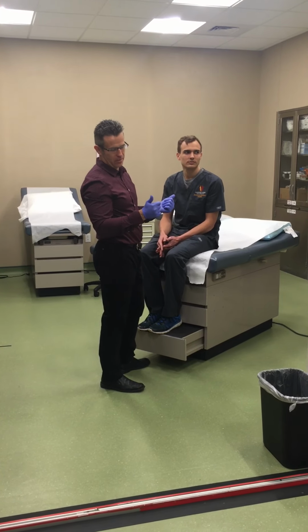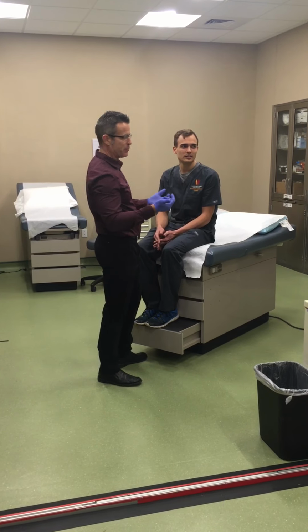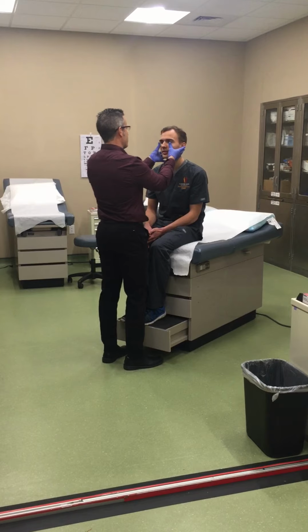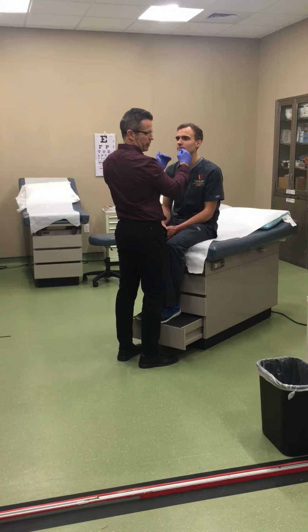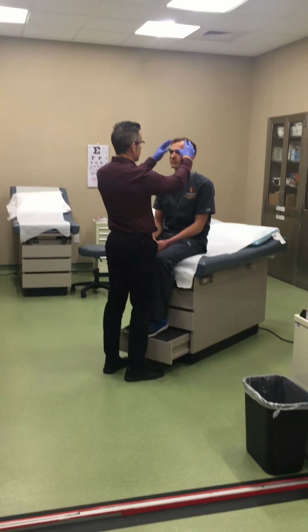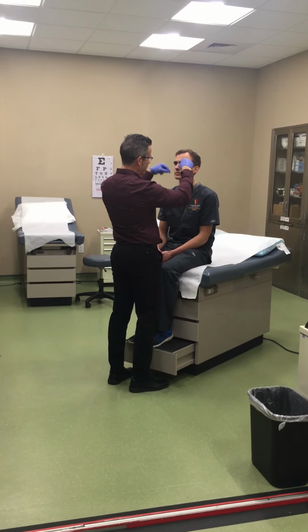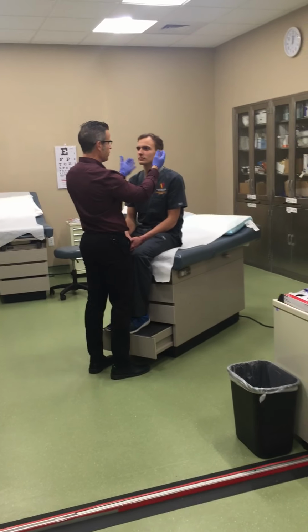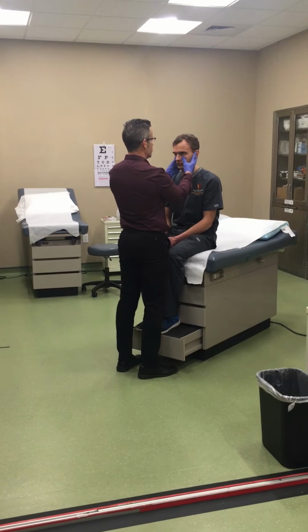Bulbar. Bulbar and palpebral. Remember, palpebral is down here connecting to the actual inferior eyelid, and actually the superior eyelid as well, but I'm not going to worry about flipping his eyelid out unless he has a problem. So this would be sufficient for palpebral. Put your head down so you can see.